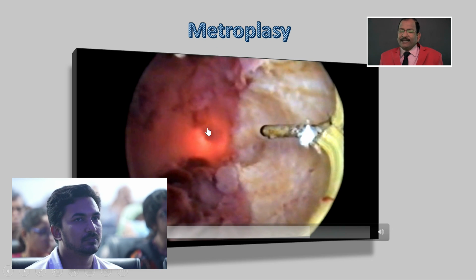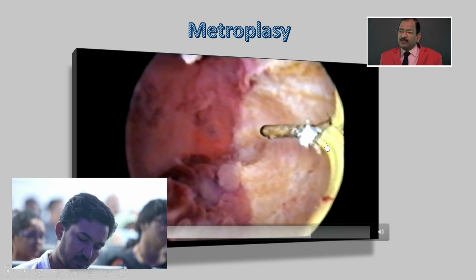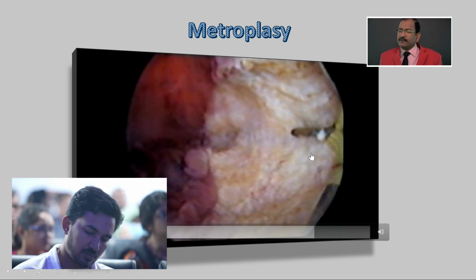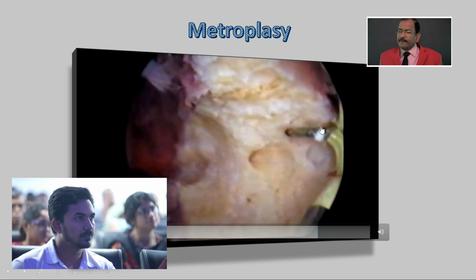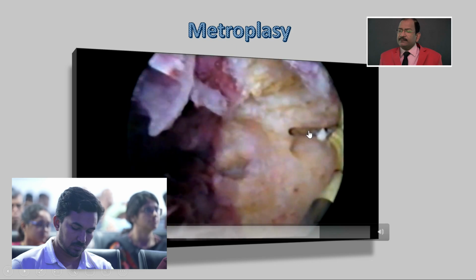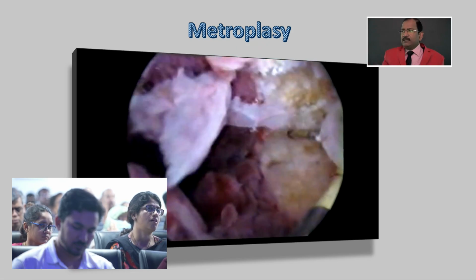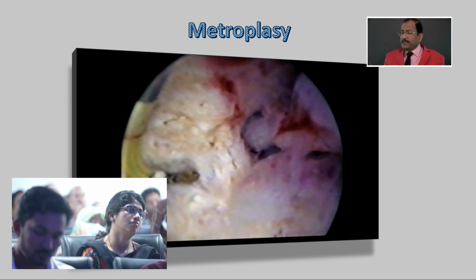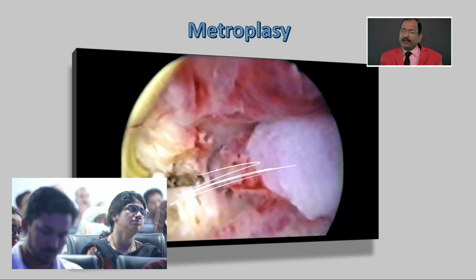This light is saying, don't come near me, remain away from me. So, this side is over, now you will always cut the other side where the light is not there. This way slowly, this side is still dark. You can rotate this Collins knife to any side, this side or that side. Now it is rotated to that side, and this side still needs a little bit, and you can cut.